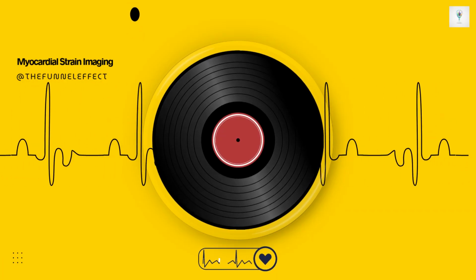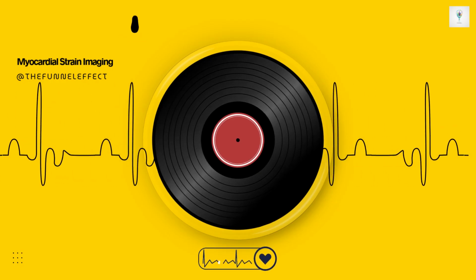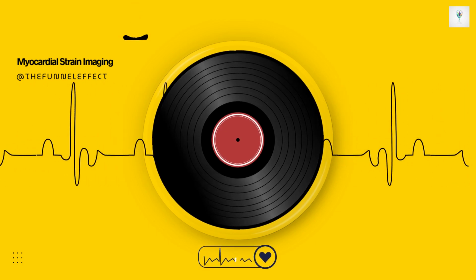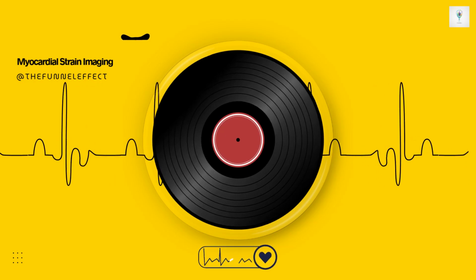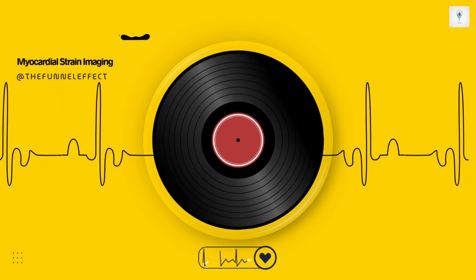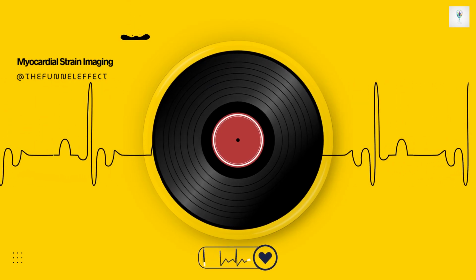The Achilles heel of TDI was that it was highly angle dependent, meaning you had to align the ultrasound beam perfectly parallel to the direction of the muscle motion you were trying to measure. If you were off angle, your measurement was wrong. Trying to do that reliably for multiple segments of the LV wall in different directions was just too time-consuming, very operator-dependent, and ultimately not reproducible enough for routine clinical use.